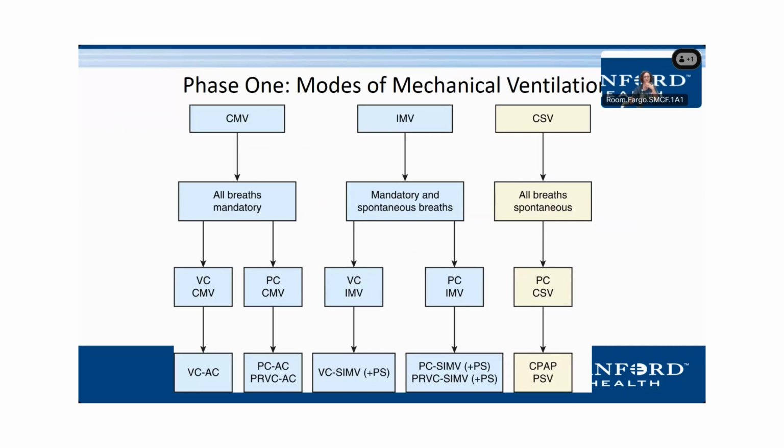There is no universal language when it comes to modes. So again, you're just going to have to dig through your ventilator. I would say the only mode that's the wrong mode of ventilation is CPAP and pressure support. That's not something that you're going to initiate on your patient unless you're using non-invasive ventilation, right? CPAP and pressure support are very typically used for non-invasive ventilation. And then during the weaning process, we use CPAP and pressure support. But initially, we're going to choose one of the control modes of ventilation.